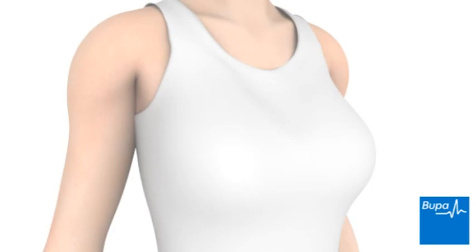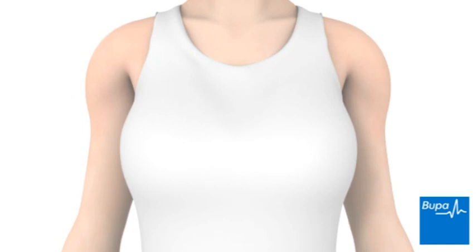This animation will show what happens during a Fine Needle Aspiration Breast Biopsy procedure. Click the navigation arrows below the animation screen to play, pause, rewind or fast forward the animation.